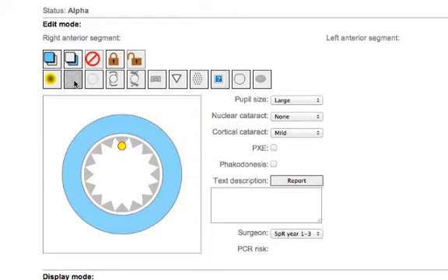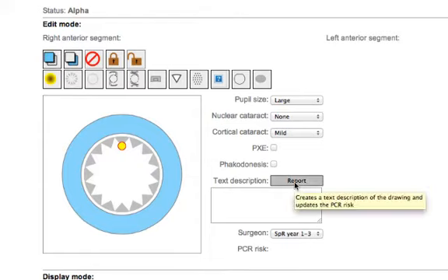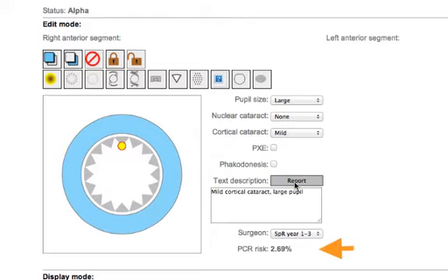What we can do is calculate the risk of that complication. If we click on the report button, it tells us the risk is 2.69%. That's not too bad. I'd rather zero as a patient but that's the reality. So this is almost like personalized consent.